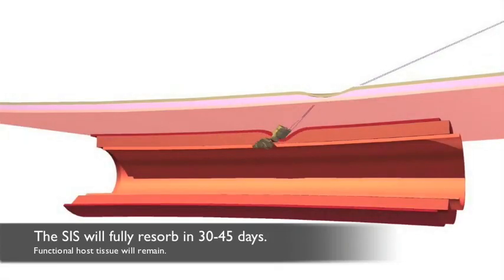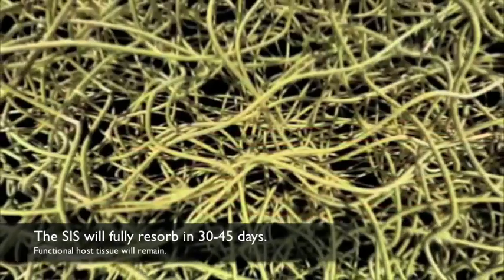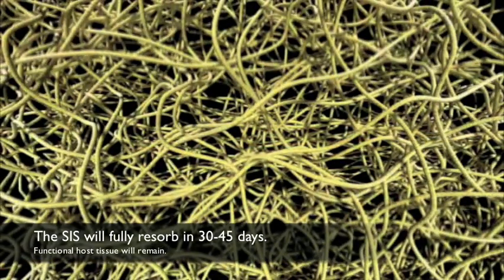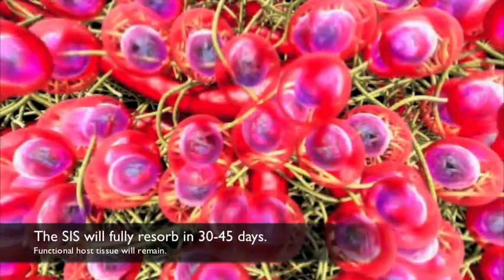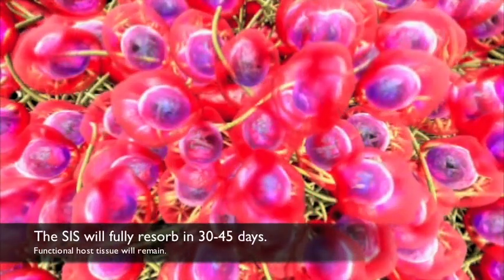The acellular matrix FISH uses, SIS, has ideal properties protecting your patient against infection, thrombus buildup in the arteries, scar tissue formation, and nerve damage.